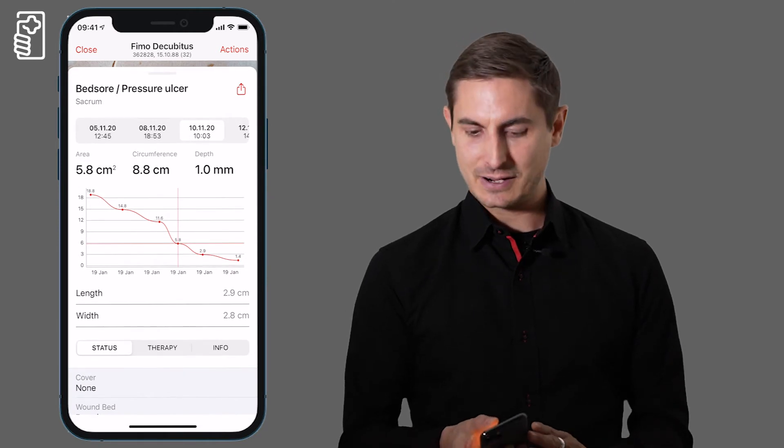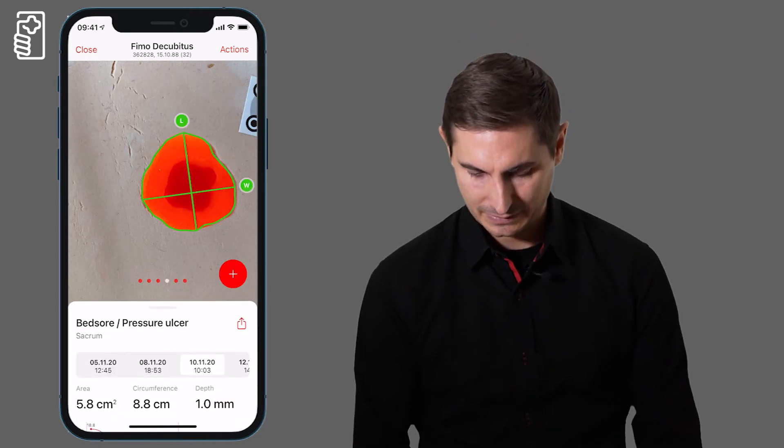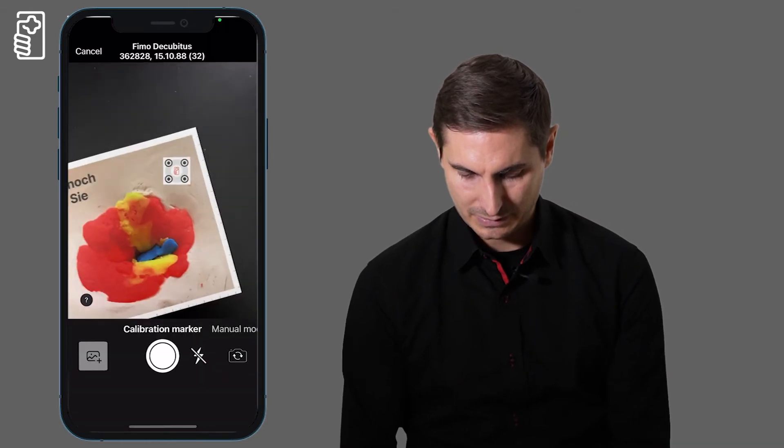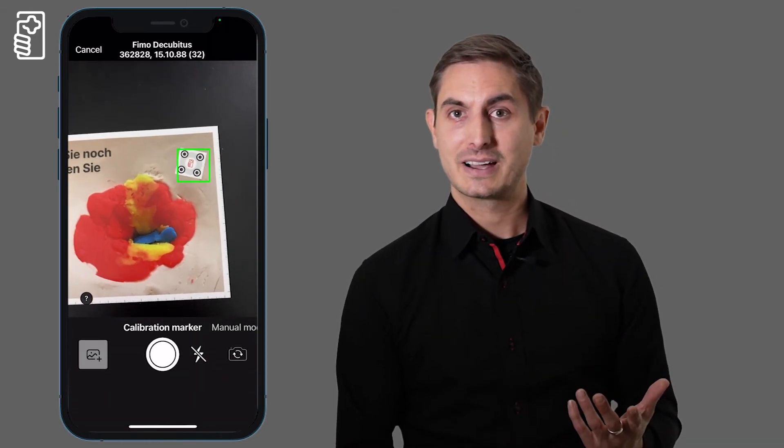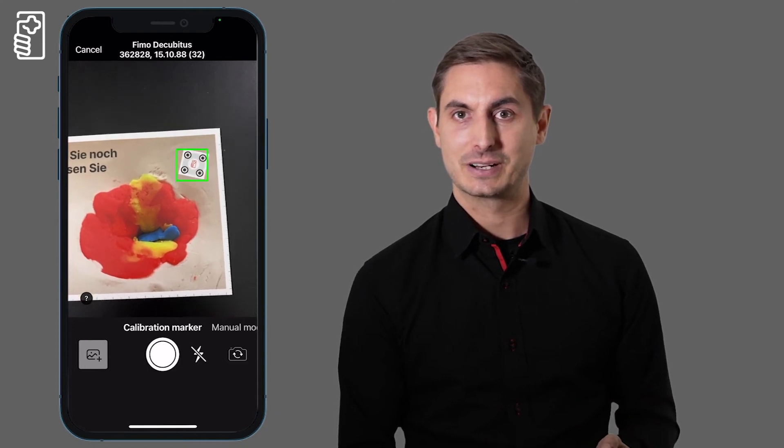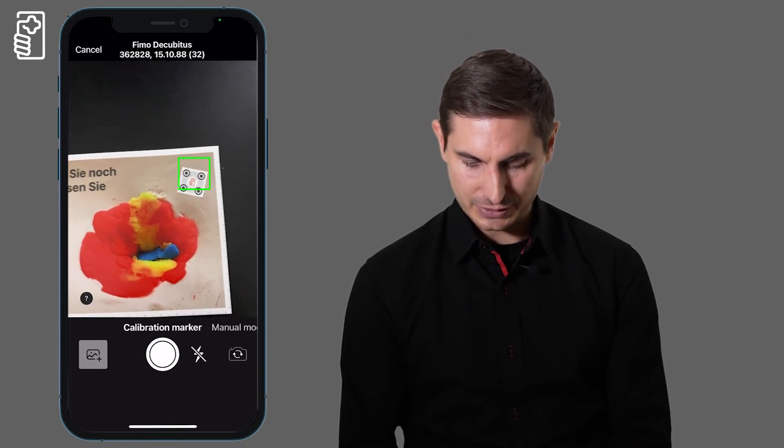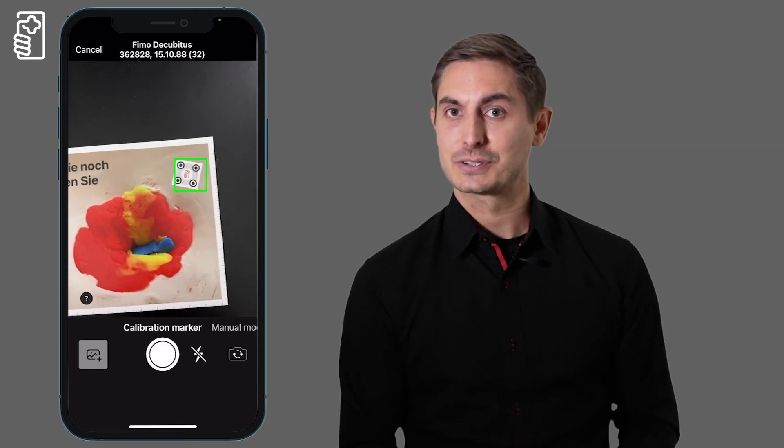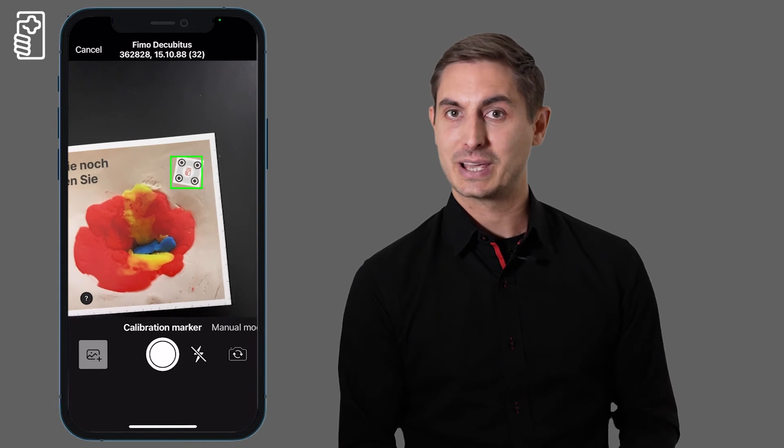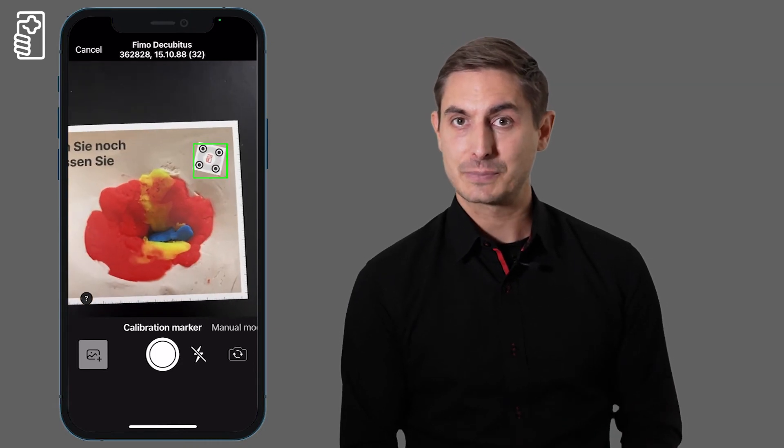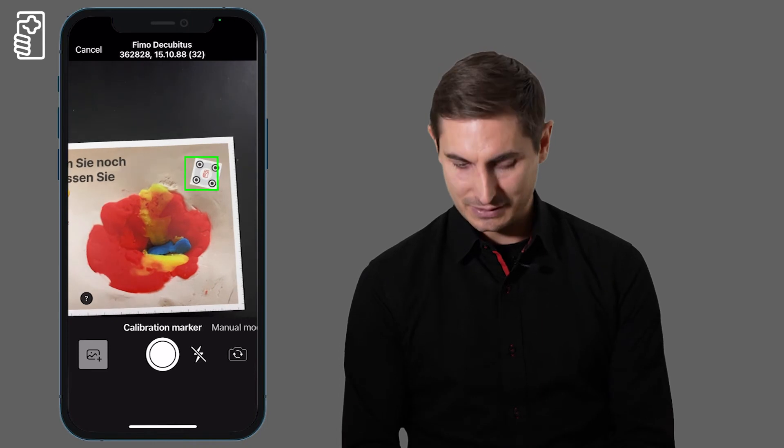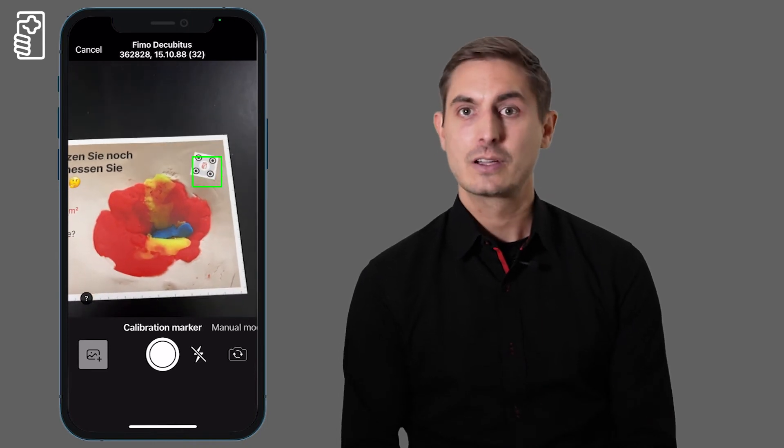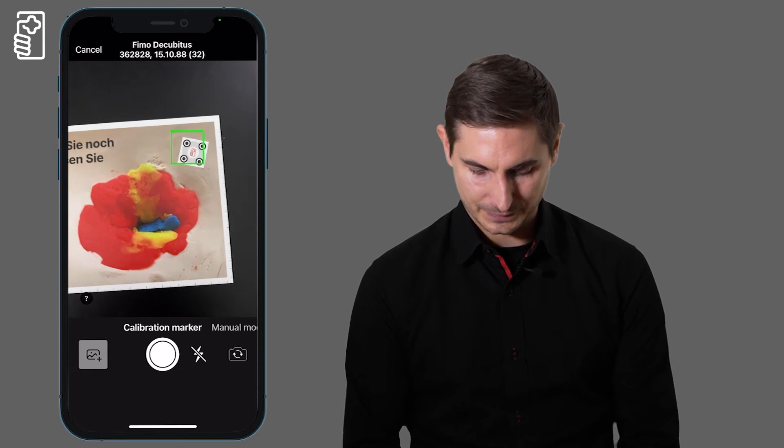Let's now create a new assessment. For the measurement of the wound I have two different methods available. Either using the calibration marker or as an alternative I can also use a physical ruler for a manual calibration. During the capturing process I am guided by the green rectangle which turns red if I am not parallel to the marker.